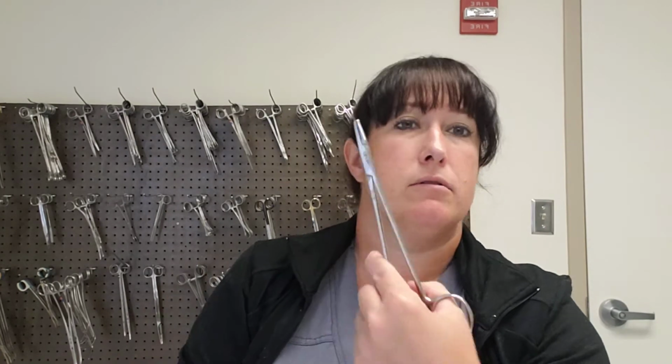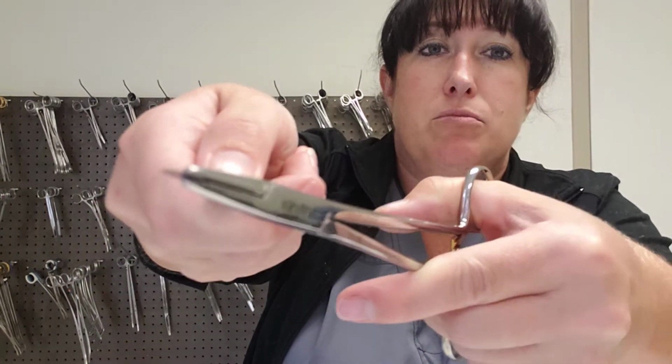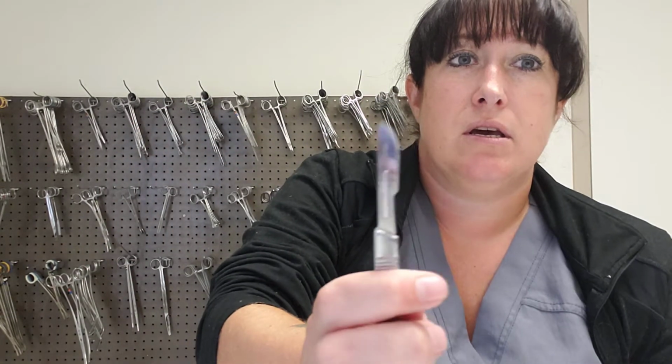Oh, I've got the wrong one. That's a 20. You're going to do the same thing though. You can grab it right there. And then I'm going to take this, and unfortunately it's going to be hard for you to see in the picture. We'll practice this in the lab. But you'll put this on here a certain way. It's easier if you have it down lower, and you need to make sure you're pointing away from yourself, because otherwise you can hurt yourself. But what I did is I put this on, and then now you can see it. We'll practice in the lab. I know it was hard to see in that video.